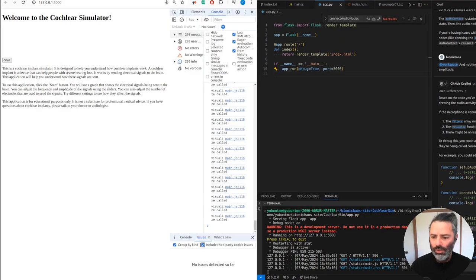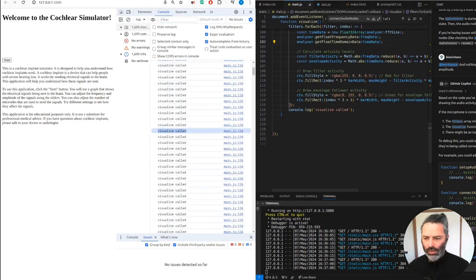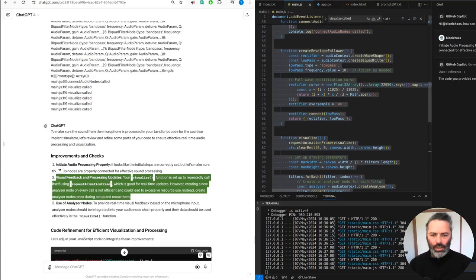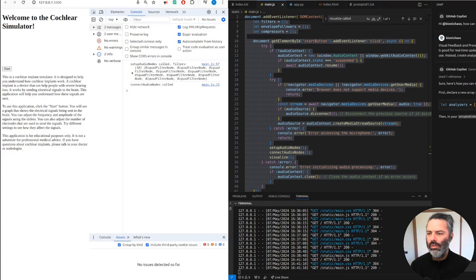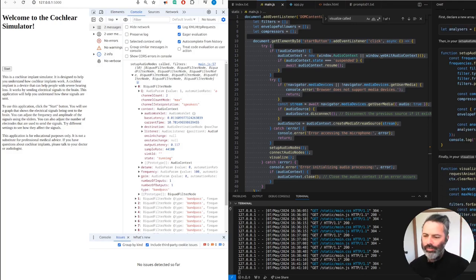Visualization is called. Filters are there. So visualize is called, okay. Get rid of the console log. It's not actually helping. Change the code, teach me. Hit the start button, try audio context, try navigator. Do we want the sampling rate so high?